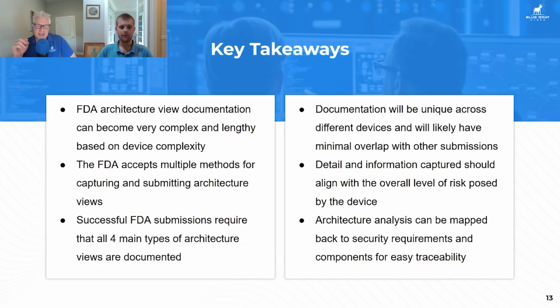I just want to clarify something. So you could have a super complex device that could actually be low risk. The example you gave was the oxygen concentrator versus a drug infusion pump. They're both fairly complex, but it's really about the risk to the patient and some of the complexity that drive the amount of documentation we need in these use cases. These are architecture views, sorry.